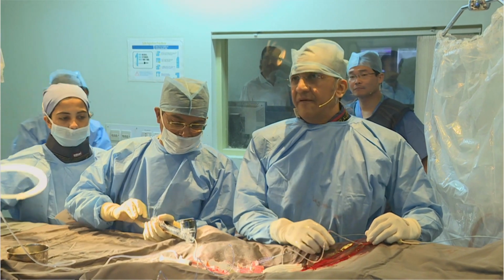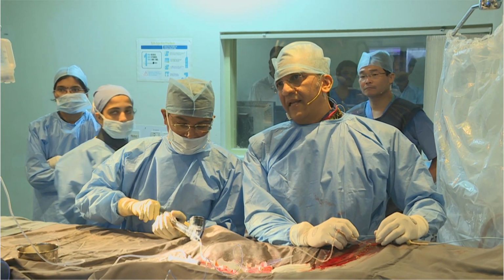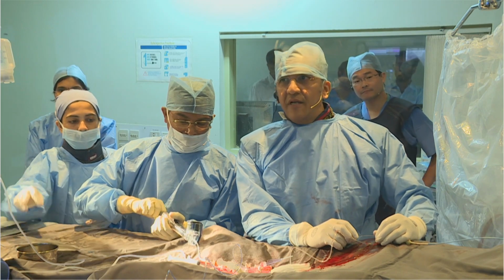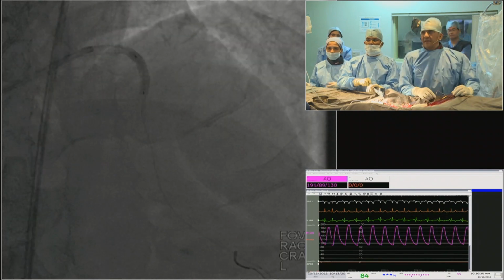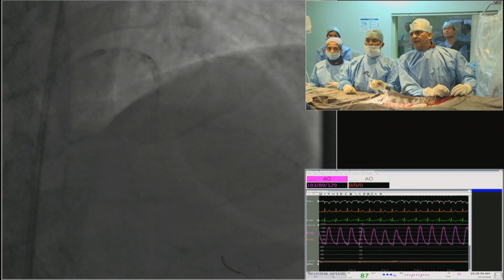Okay, can we see the picture? Kirti, we are looking at you. Can you show the angio? Yeah. So he's got it across. Please don't give me just the angios. Just reduce the cranial, please.